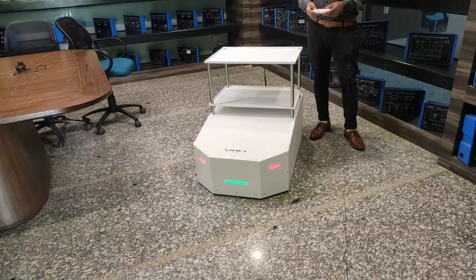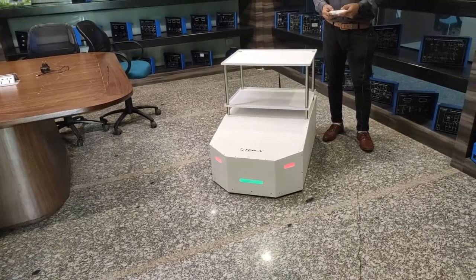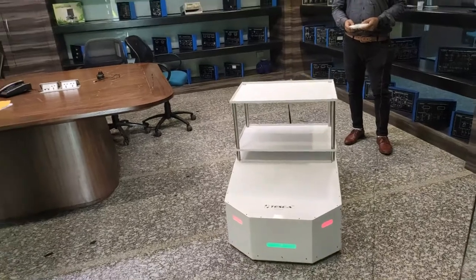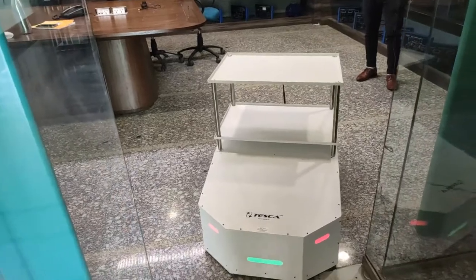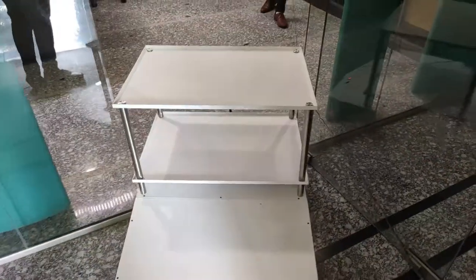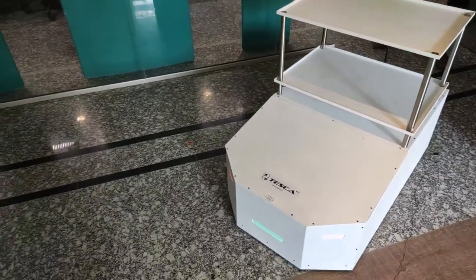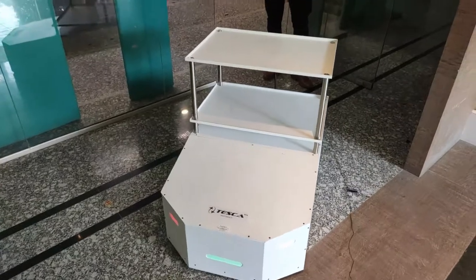Now we will run this cart and demonstrate how it serves patients by delivering all required items. By moving this remote control, one can easily control the cart, and it can be operated at a suitable distance.